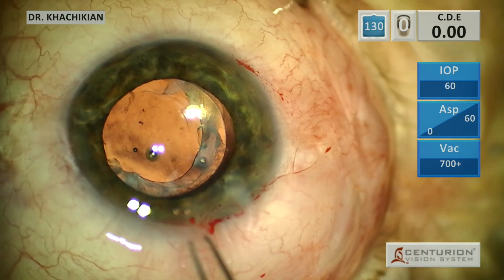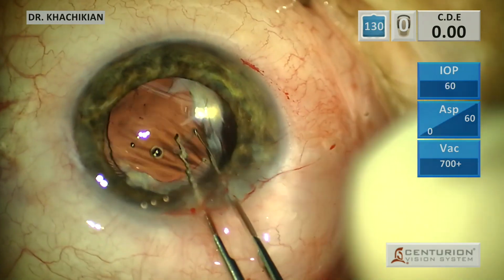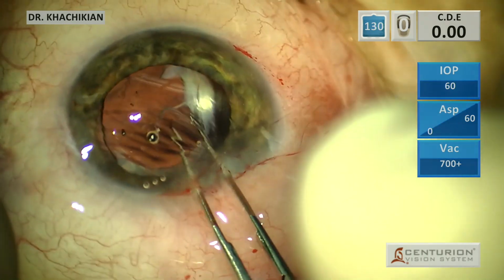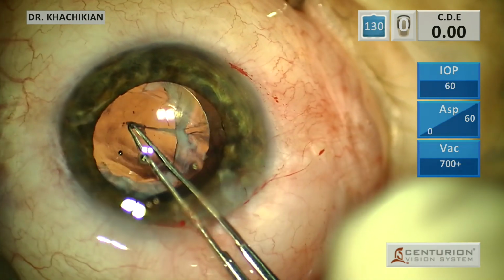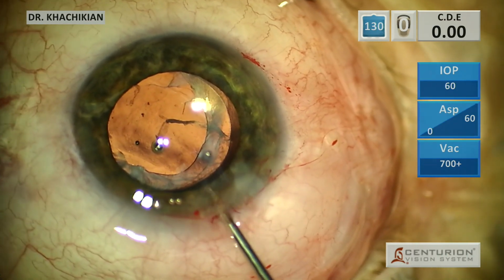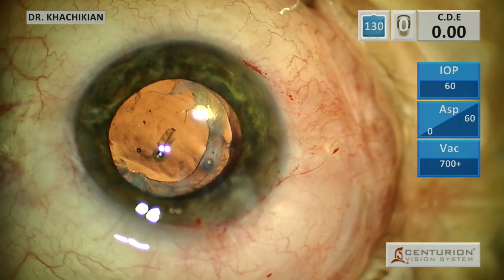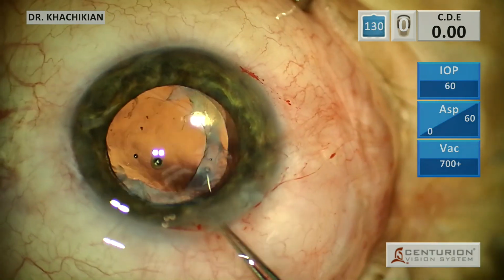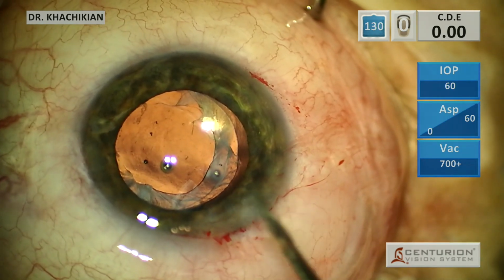And I think this will give this patient a better view, less distortion. Remember, he's already had retinal surgery, so I don't know his vision is going to be optimal to begin with. I don't think it's going to be down to 20/20, because I think it was a pretty big retinal detachment. But it'll give a better view. There'll be less scarring. He can have a YAG in the future, because I think he'll need that posterior YAG. And I don't think the anterior capsule is going to come down any further. So that's much more round.